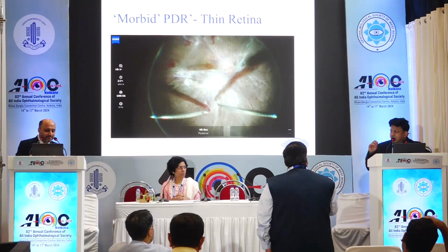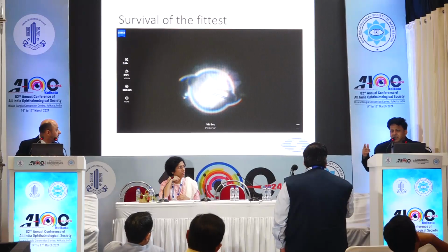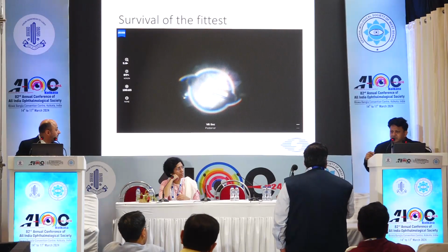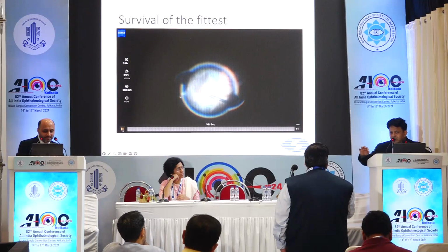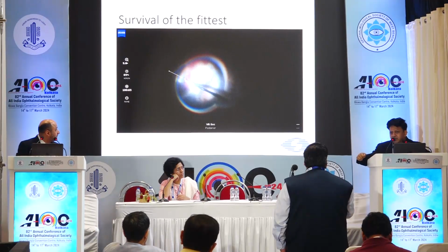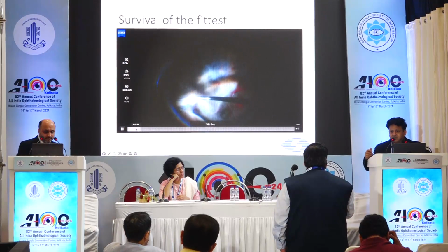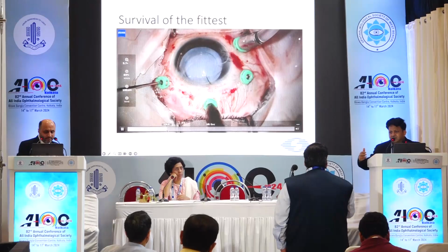One more thing I would like to say: when I started doing this technique, we were using 20 gauge systems at that time, right? And at that time, what I used to do initially was make a small hole just near the disc to access the disc properly, to hold the membranes properly. And I had at that time designed a forceps which was just like your vertical scissors. It was not a scissor but a forceps.